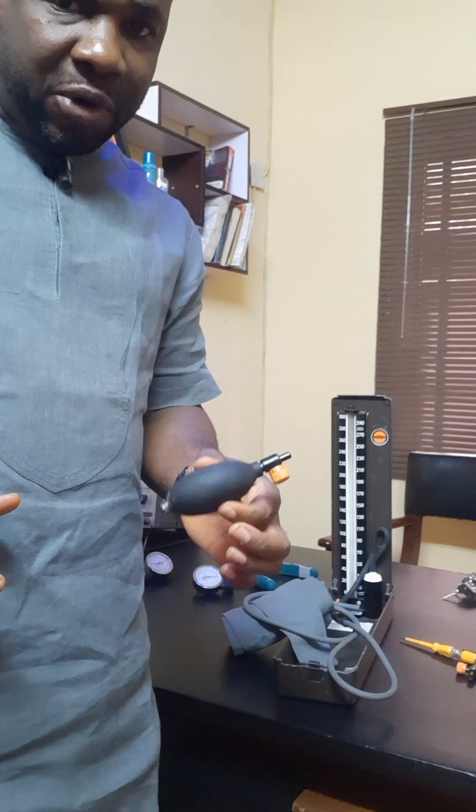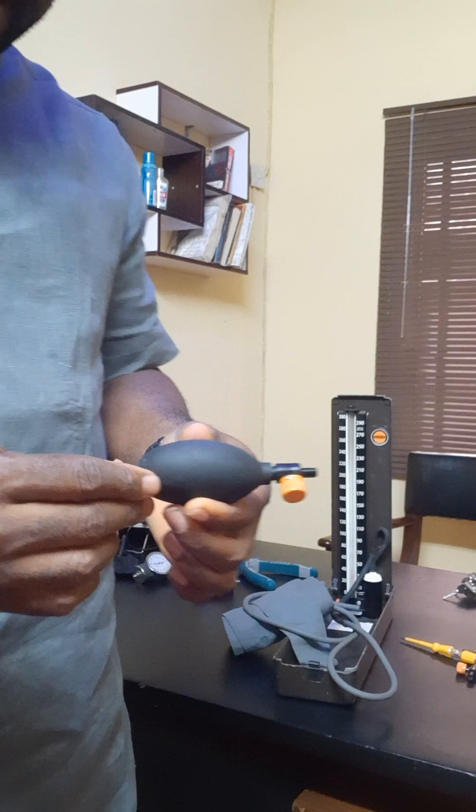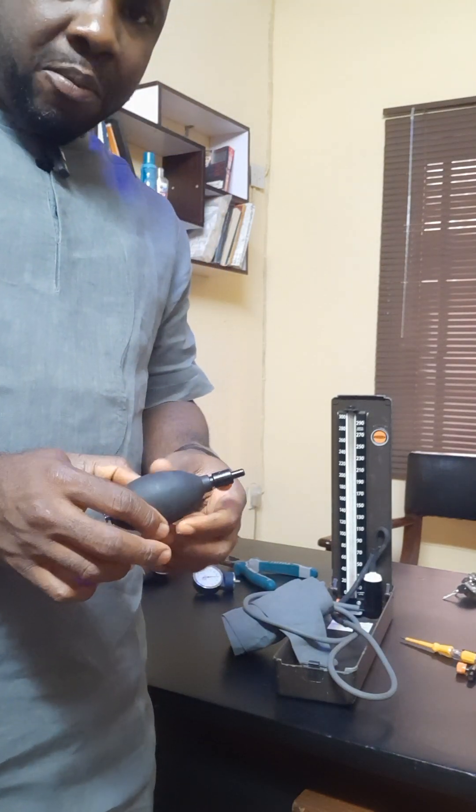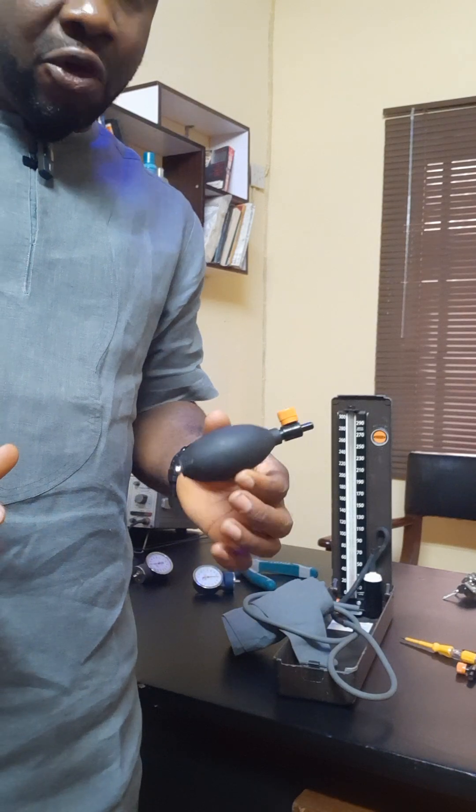I will compress it. If I compress this very pump, I am not expecting it to come back to its original form — that is if it's okay.